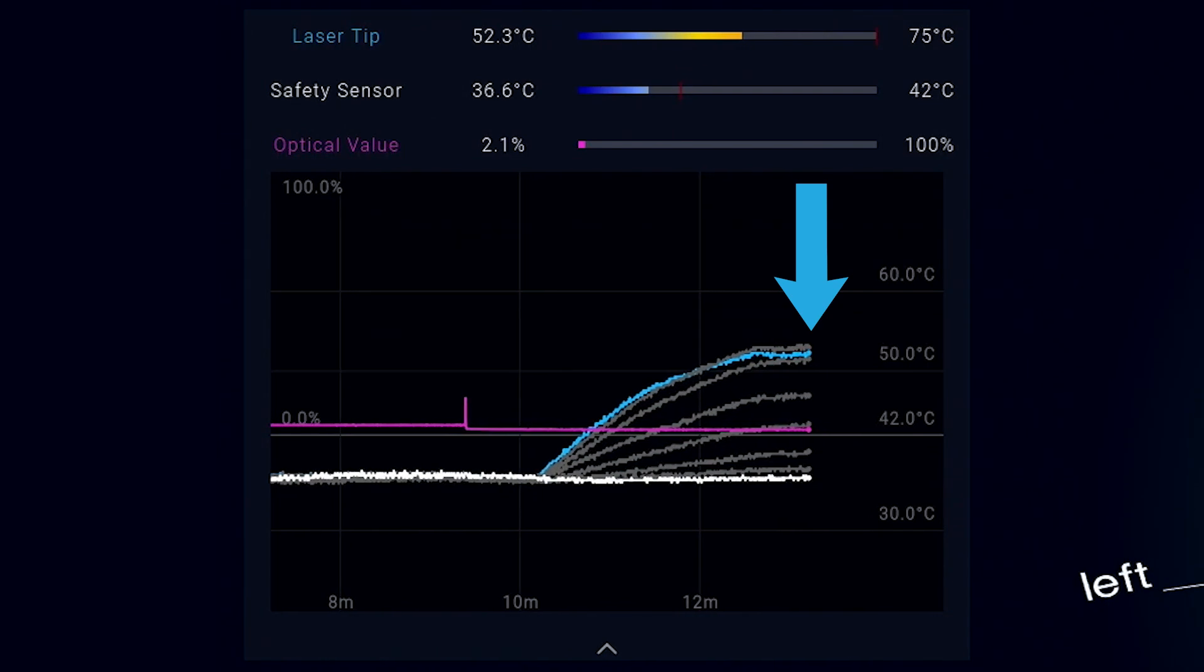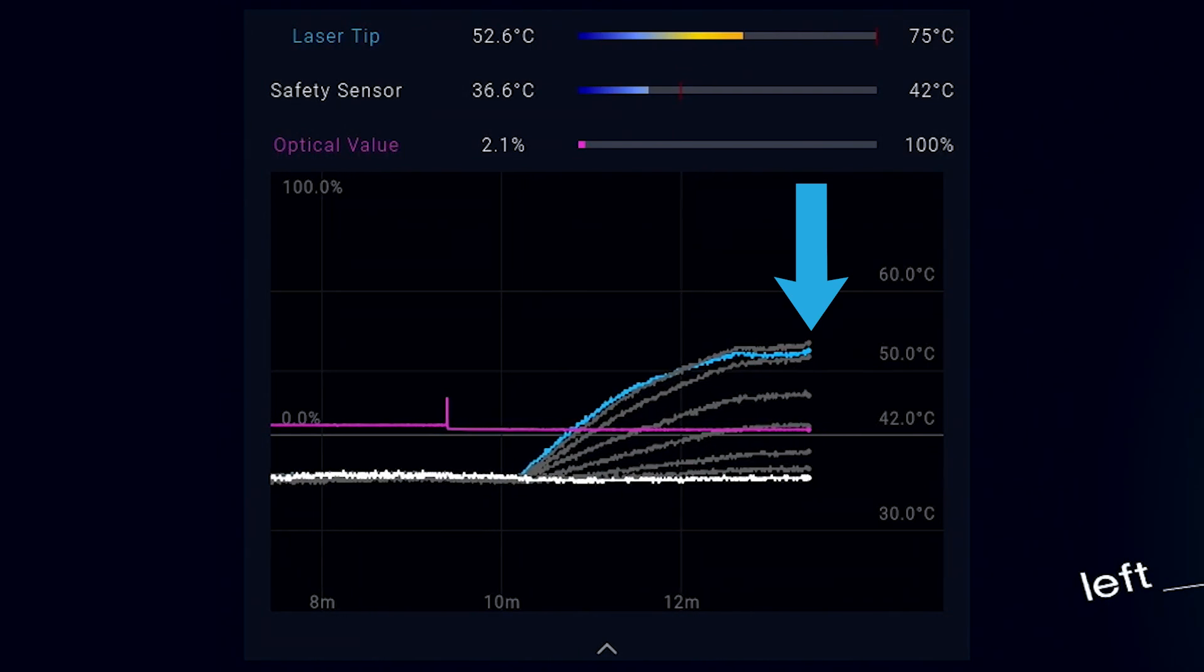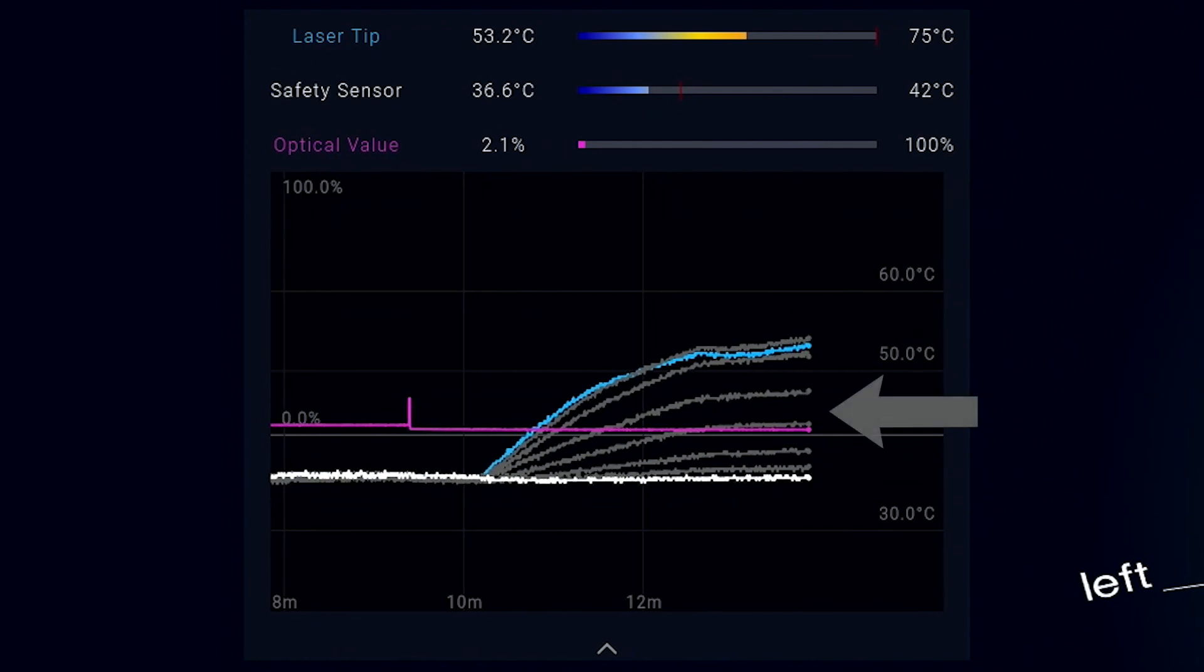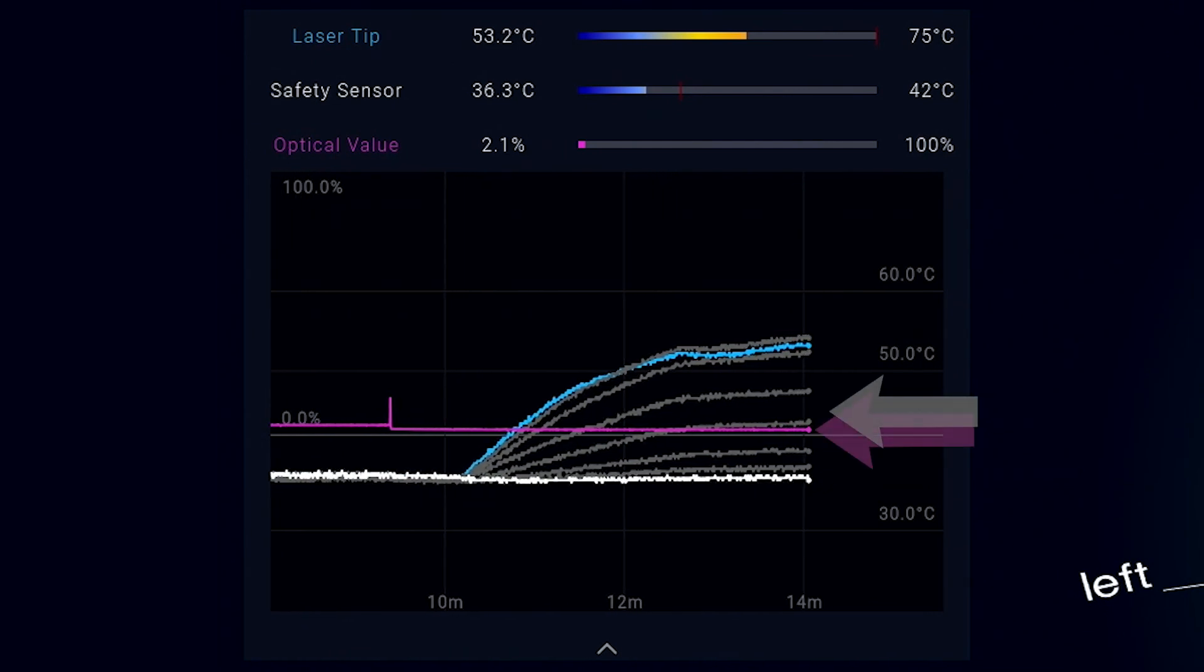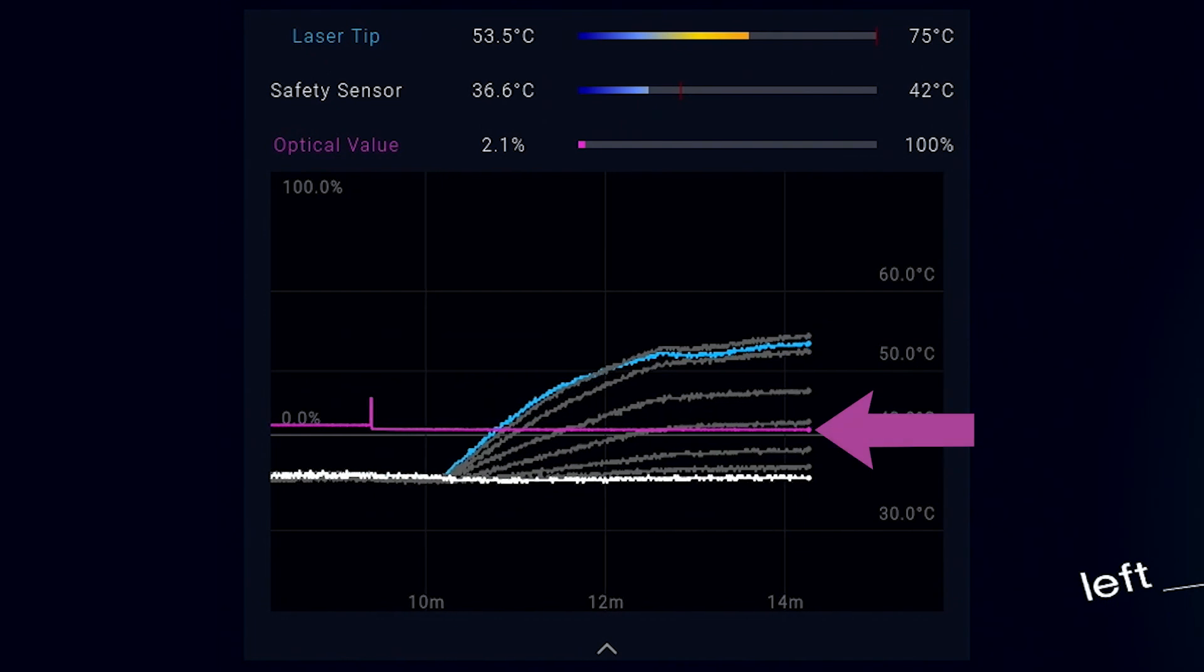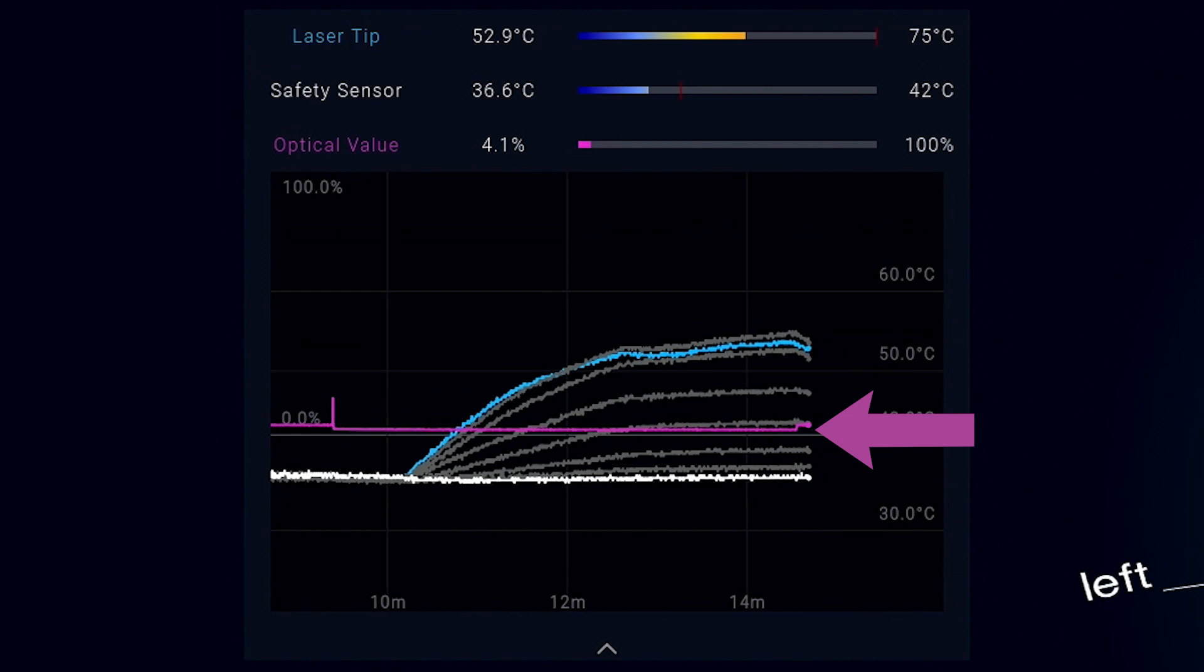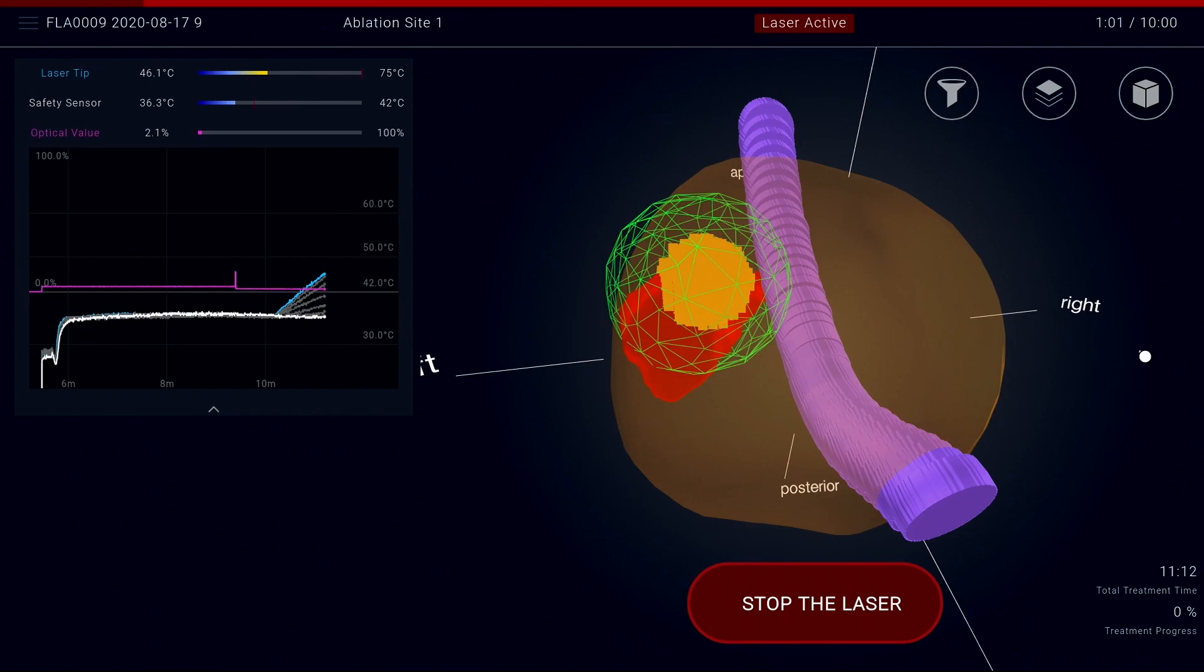The thermal probe will cause an automatic shutoff if the laser tip temperature exceeds 75 degrees. The intervening thermocouples are displayed as gray lines. A pink line shown here corresponds to an experimental optical sensor which may monitor tissue ablation in the future. Approximately 5 minutes is required for each ablation.